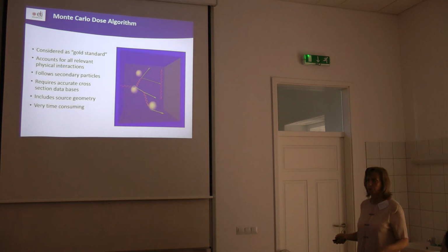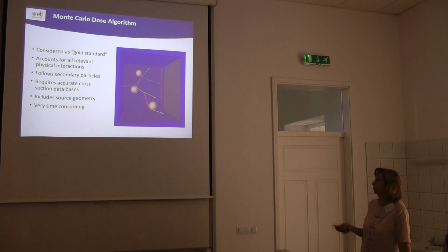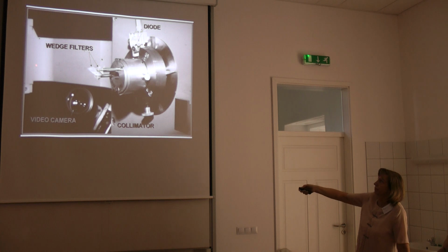The pencil beam algorithm is used recently, worldwide, and recently the Monte Carlo calculation algorithms were tailored for that purpose, eye proton therapy, which reduced the calculation time and resulted in calculation of the dose distribution of the eye. It can be modified as well with wedges, and the patient is looking at this small diode.